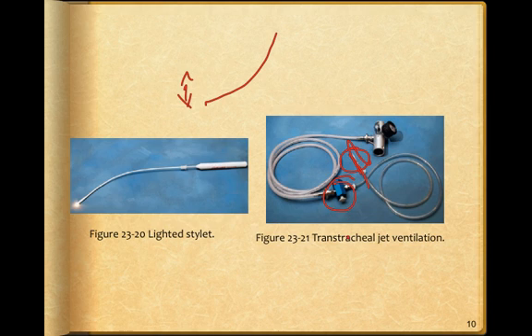We still have a problem, though, with air trapping. So the oxygen goes in, but the ventilation comes out really slowly because normal ET tube size, about like that, well, the lumen on a 14 gauge angiocath is very small. So they will retain CO2. Just be aware of that. It'll take about 4 to 5 times longer than it took for inhalation using a jet insufflation device.